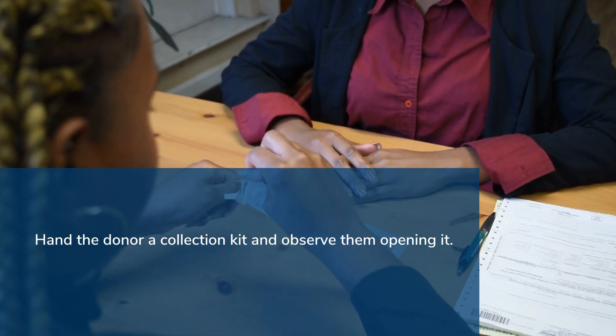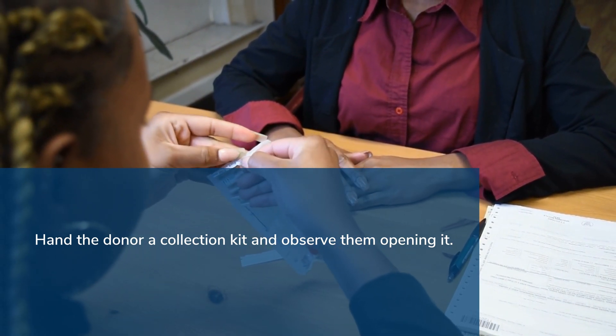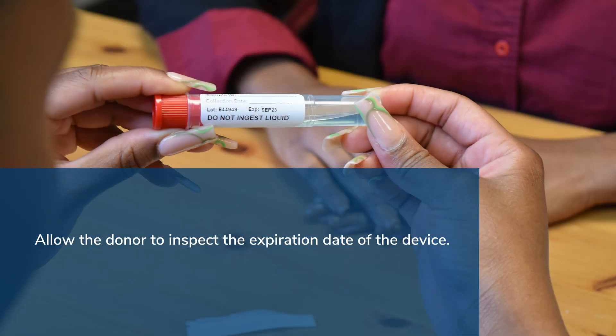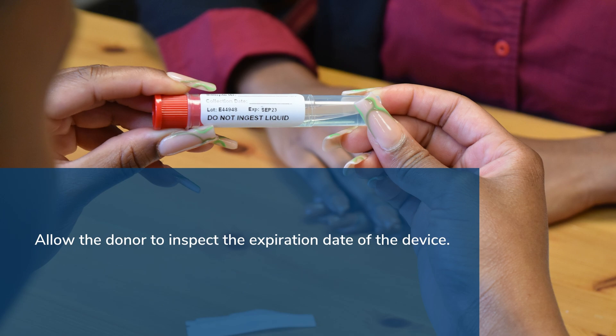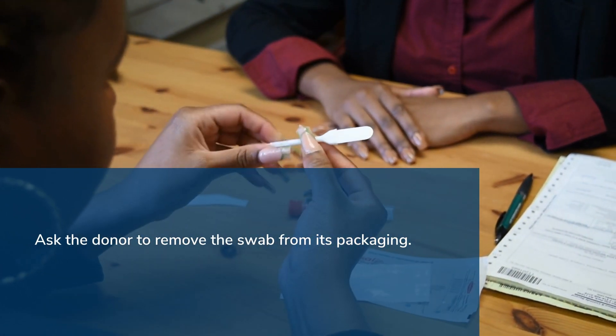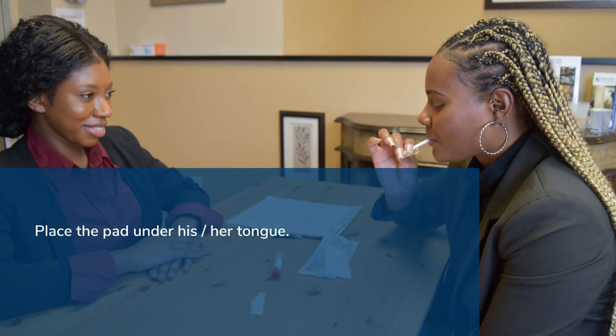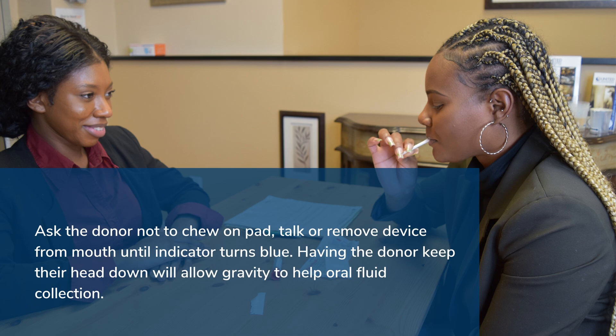Hand the donor a collection kit and observe them opening it. Allow the donor to inspect the expiration date of the device. Ask the donor to remove the swab from its packaging and place the pad under his or her tongue. Ask the donor not to chew on the pad, to talk, or to remove the device from his or her mouth until the indicator turns blue.